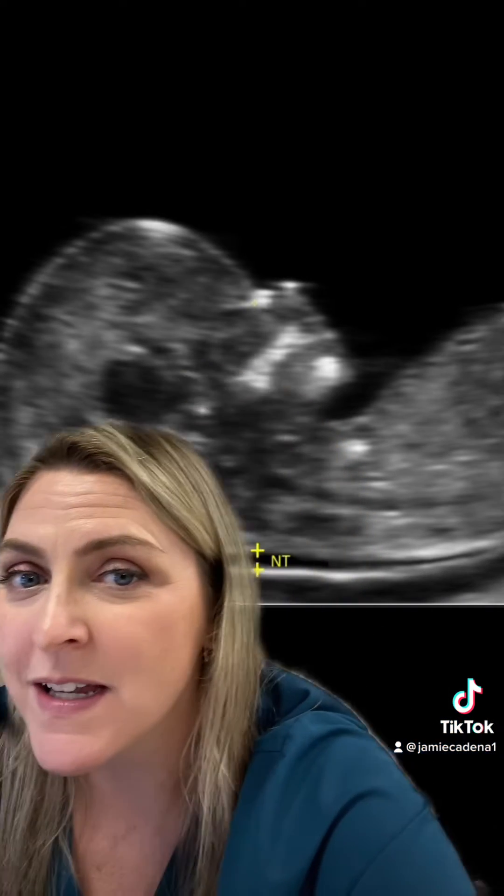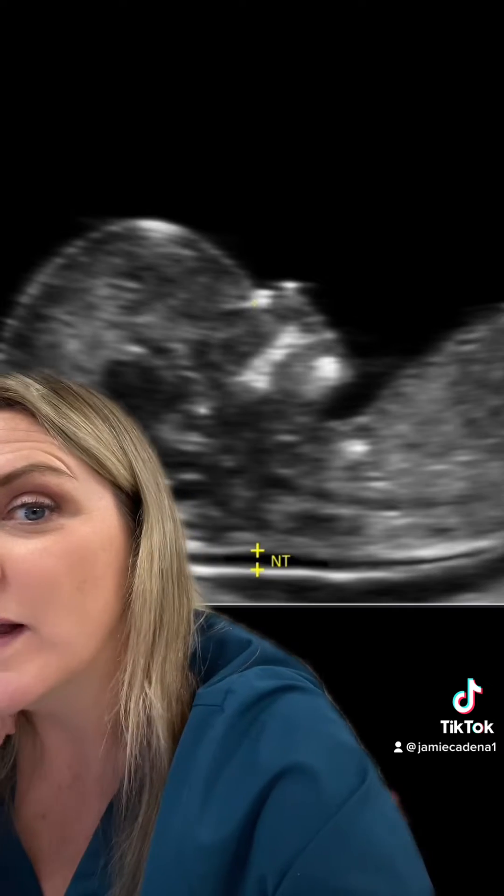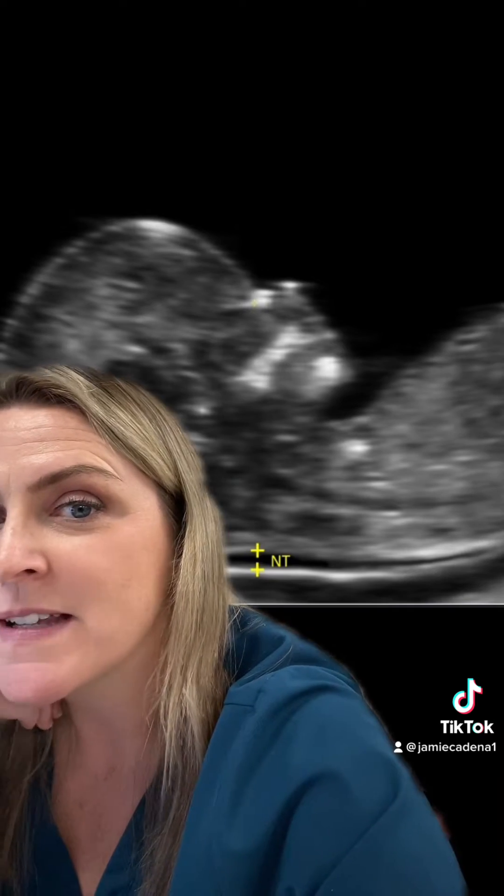They're gonna get your baby in this beautiful little neutral profile position right here, as you can see. You can see that we have the nasal bone, the nasal tip, the maxilla, the midbrain, the little chin there, and then you'll see the little fluid on the back of baby's neck.